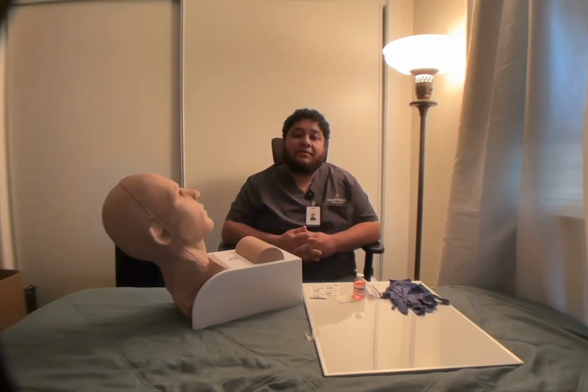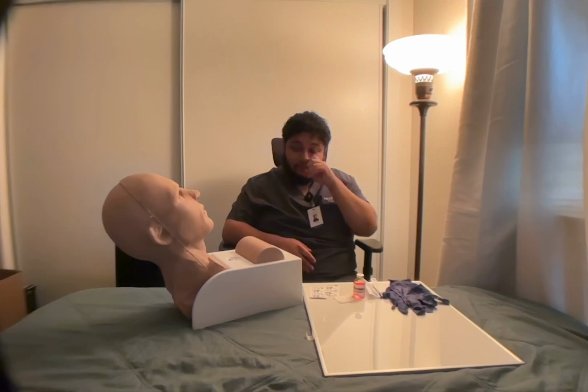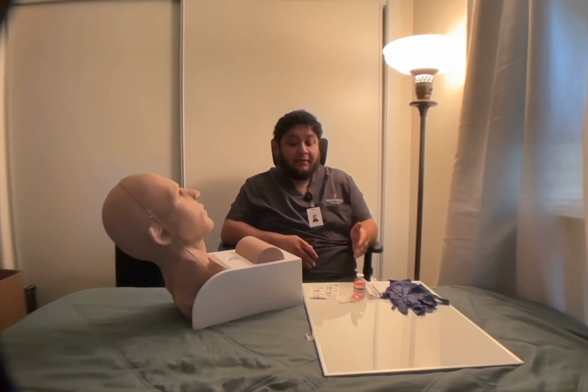Hello, my name is Christopher Jamie, and I will be performing the intramuscular injection skills video. Here's my badge. These are my supplies. Okay, so for my supplies, I have clean gloves, my syringe and my needle, medication vial, gauze, alcohol swab.